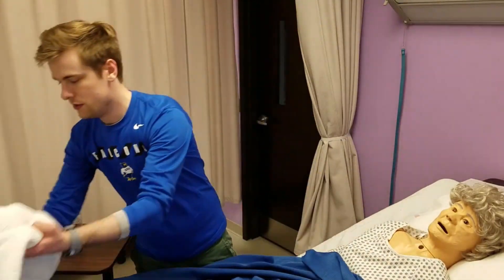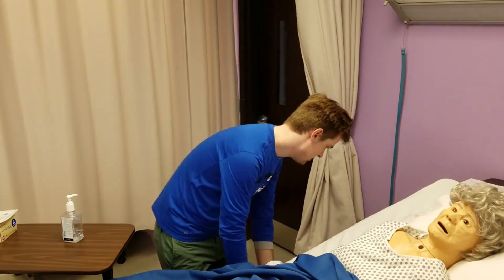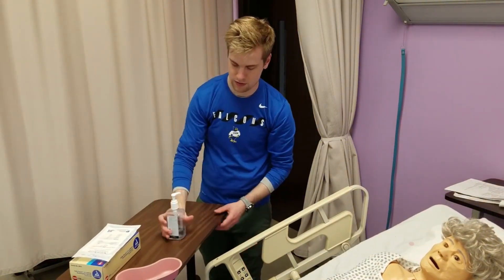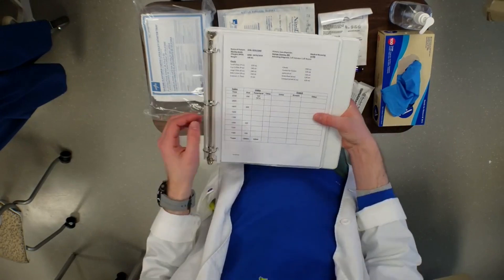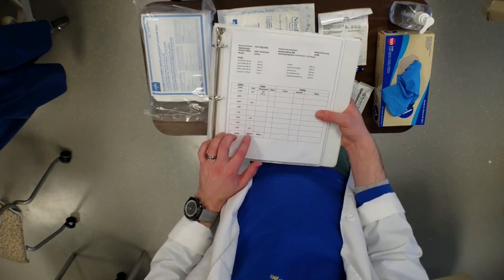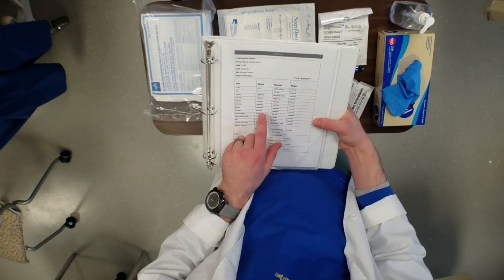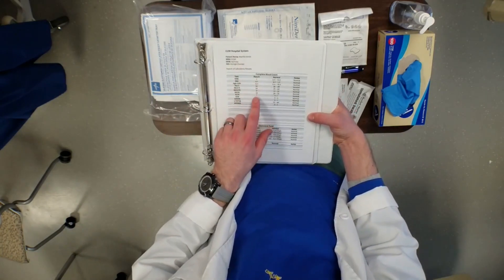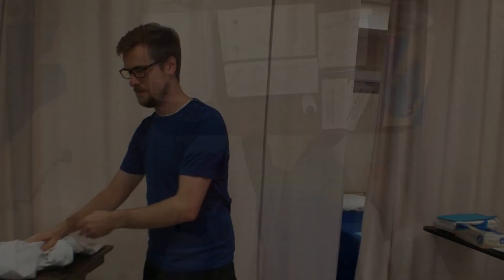Before leaving the room, clean up the patient with soap and water as needed, dispose of any additional supplies, and reposition the patient so that they are comfortable. Thank the patient and ask if they need anything else. Lower the bed, raise the upper guardrails, and give the patient their call light. You may then go to the med room for a debrief. At that point, discuss with your evaluator what you would document: start with your assessments, then the type and size of catheter inserted, the amount of fluid used to inflate the balloon, characteristics and amount of urine obtained through specimen collection, the patient's response to the procedure, and any education provided.